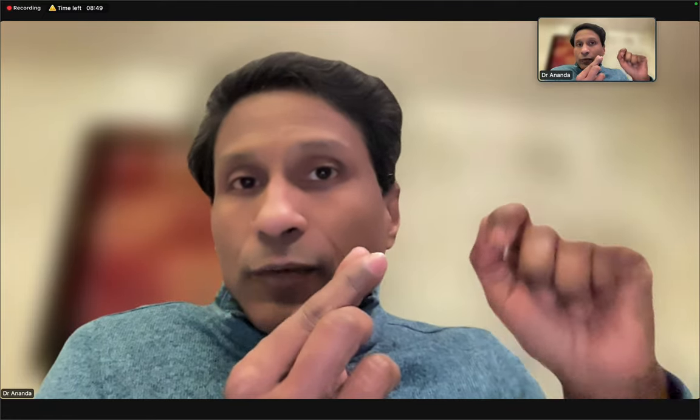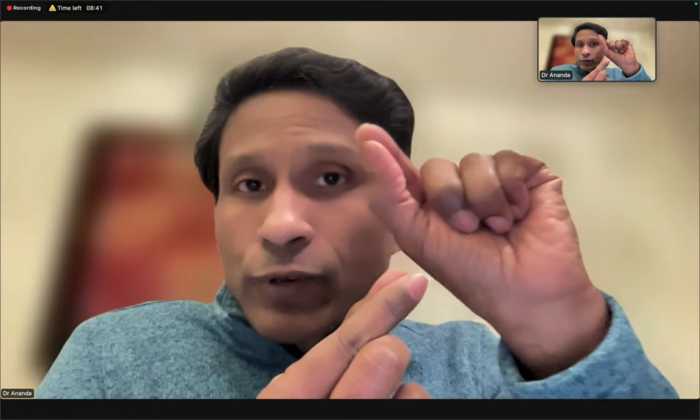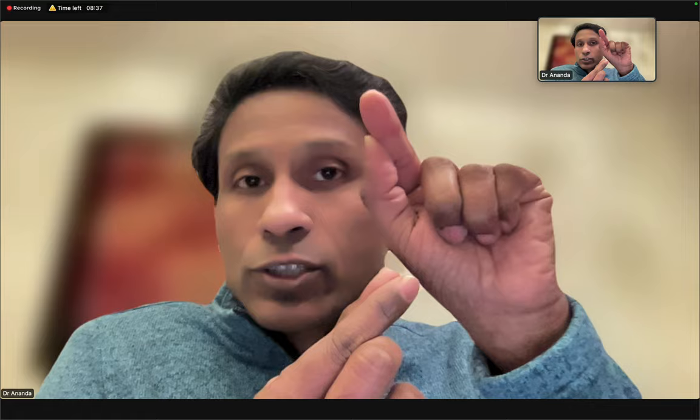And you should be able to even fix the handle again so that the handle will still work with the opening and closing function. A lot of baskets are quite good. We can remove the handle and we can fix the handle again. As long as you know this technique, you can come out and go by the side of the basket and fragment carefully in between the basket's prongs to break the stone. Once the stone is broken, you can easily take out the basket.